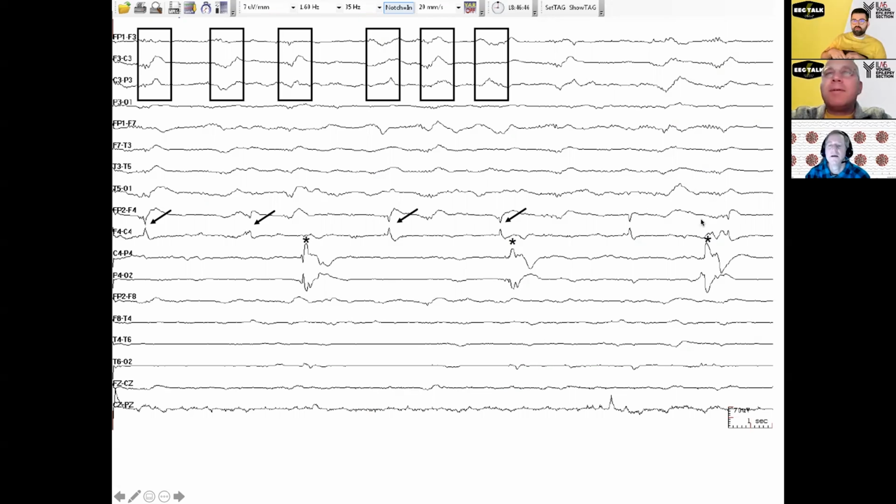MfPDs. So this one is the other point: if this is a nice spike and wave each time, it doesn't matter because there's a break between them. It's still periodic discharges. Okay. You don't call it SW. But take my word that there's three more coming after. So you have six that qualify. So this is periodic discharges, and it's multifocal. Nice. And only Dr. Westover can pronounce that.